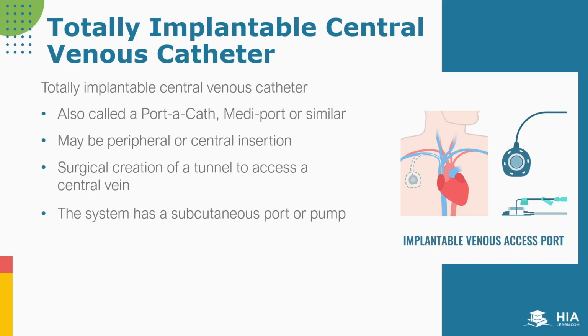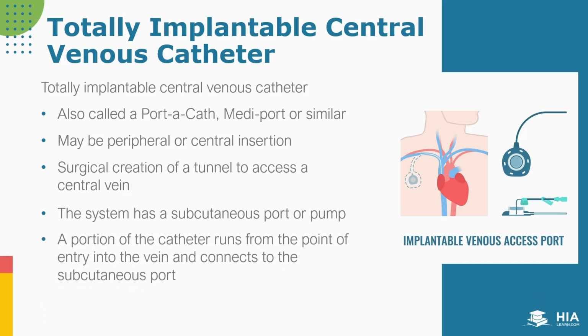The catheter tip is advanced into a central vein or the right atrium, and the other end of the catheter is connected to the port. The port is then accessed percutaneously using a needle, where medication is injected into a reservoir within the port, and then the medication is slowly released into the bloodstream. Coders should not be confused by the term reservoir. The port contains a smaller reservoir that is part of the port, not a true reservoir.